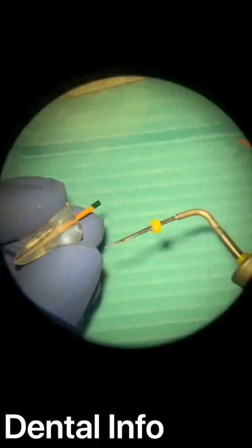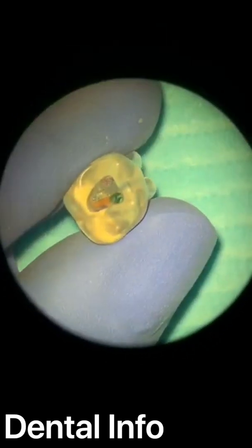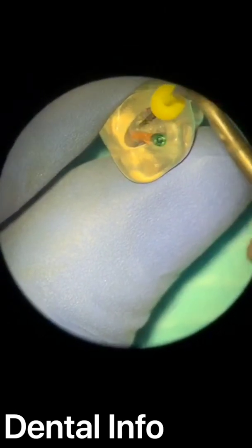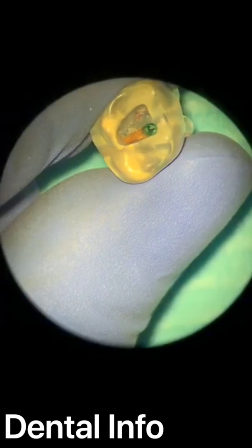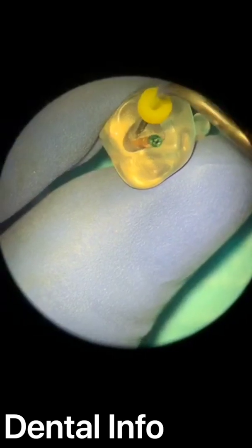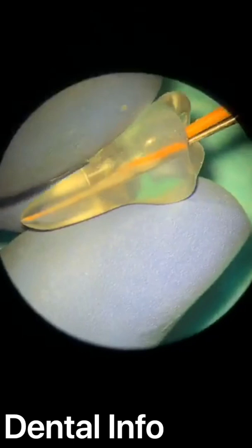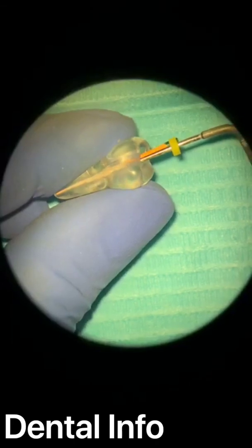Okay, so I will put my fast pack tip here beside the cone. Some people first cut the cone here and then make the packing motion. So they are making a two-step technique. I don't like the two-step technique in warm vertical compaction, especially in cone cutting. I always recommend doing it in one step, like I will do here. So I will go out with my zoom. I will put it here.